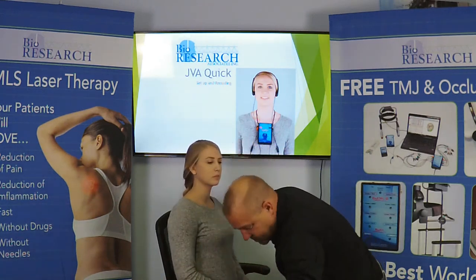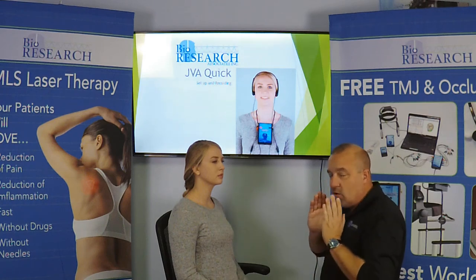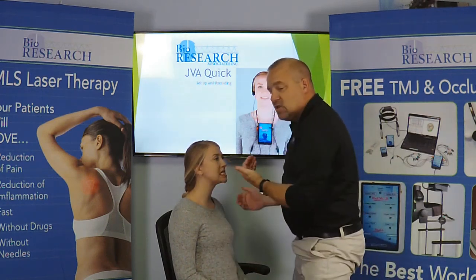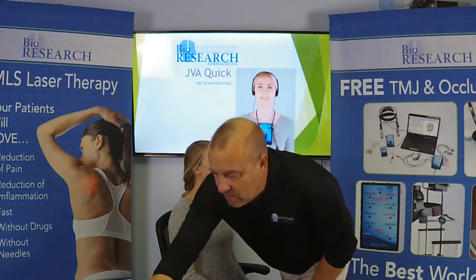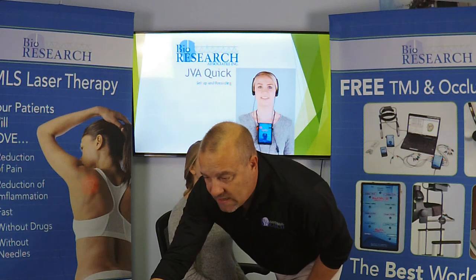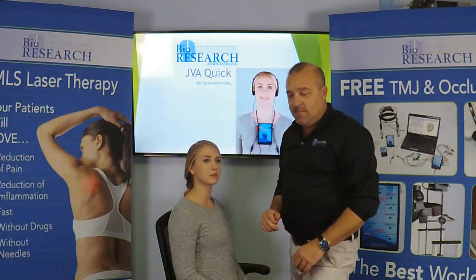millimeters. The other question that the computer will ask when we do protrusion is, what is the direction of the protrusion? Do they come straight out? Do they come out into the right? Or do they come out into the left? So go ahead and just protrude, stick your jaw out like a bulldog. She comes out straight at me, so I will simply click straight. Now, when we click OK, joint vibration analysis will begin recording.